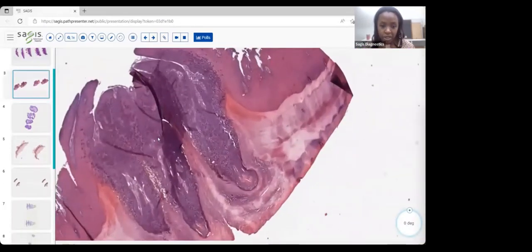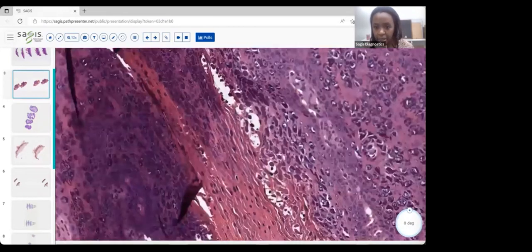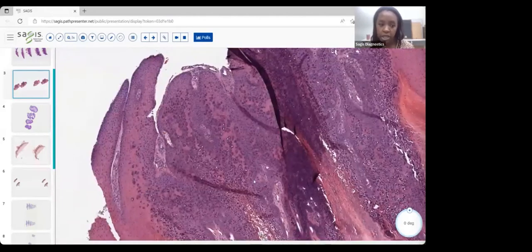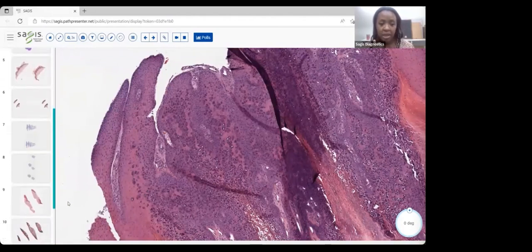So for that myrmecial wart, and I believe you can see my arrow here, this keratinocyte compared to this keratinocyte compared to another keratinocyte, they're very variable in size and shape. So that is a bit of a help differentiating between these two entities that are on the differential diagnosis of each other. And then one other thing to add with the molluscum, well, two other things actually.